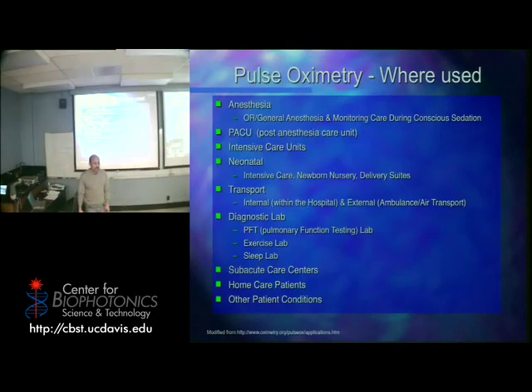They're not even using a fiber optic there, they're just using electrical wires, which is even cheaper than a fiber optic. So I'm guessing it costs them less than a couple of dollars, but they're probably charging 10 to 15 to the hospital. Usually the charge to the hospital is 3 to 5 times what it costs to make for a medical device.